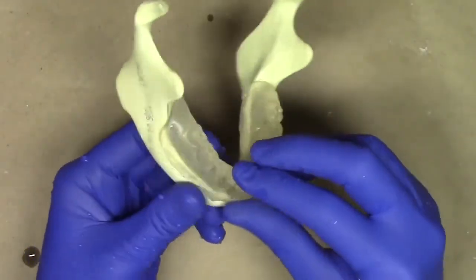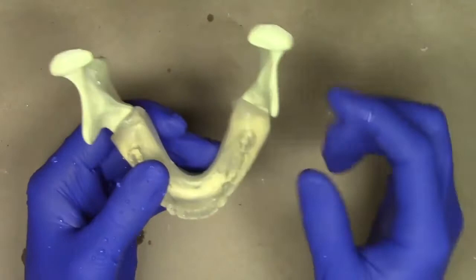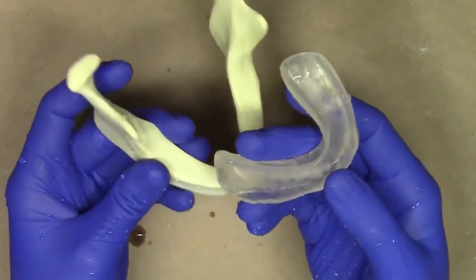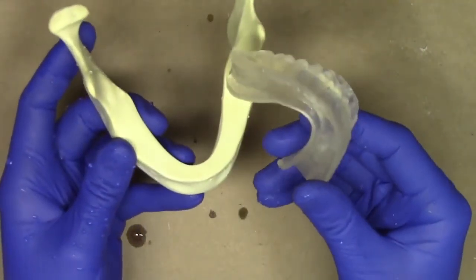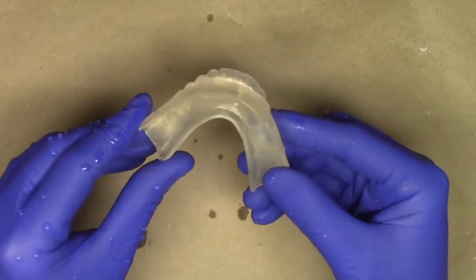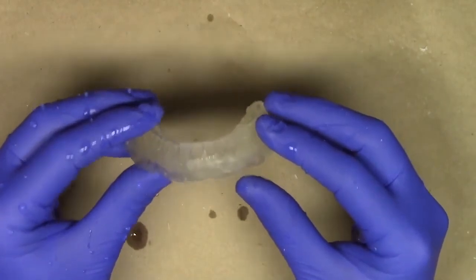the complete denture. Now, if this were a soft tissue supported surgical guide, I would recommend using some sort of disclosing media like a pressure indicating paste on the intaglio surface of the complete denture to ensure that it's fitting down all the way. Even though it's a very nice way to copy a complete denture, you do have a significant amount of resin shrinkage that, if you're relying upon this denture to be an exact fit in terms of the soft tissue, you do have to be careful.